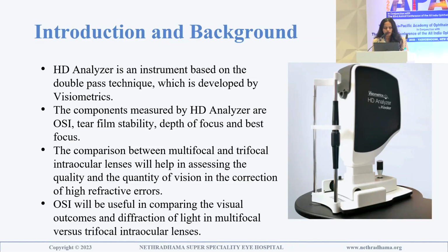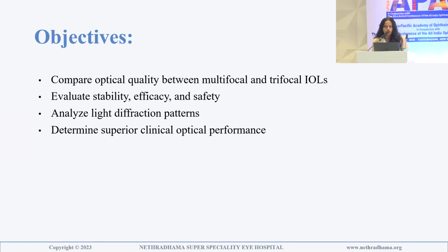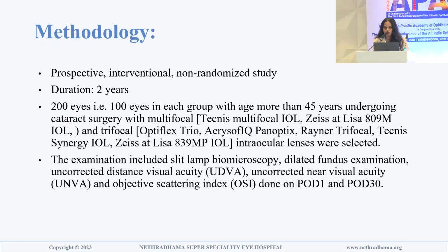So the OSI will be useful in comparing the visual outcomes and the diffraction of light in multifocal versus trifocal IOLs. The objective of our study was to compare the optical quality between multifocal and trifocal IOLs to evaluate the stability, efficacy, and safety, analyze the light diffraction patterns, and to determine superior clinical optical performance.